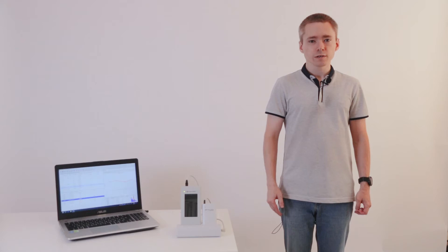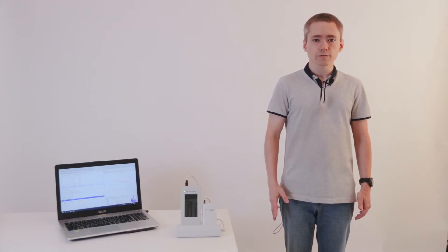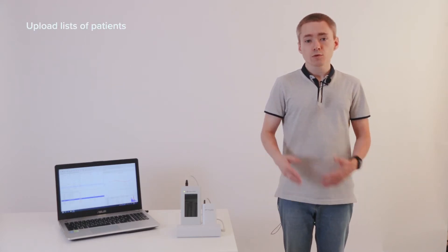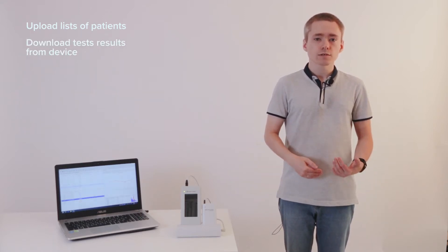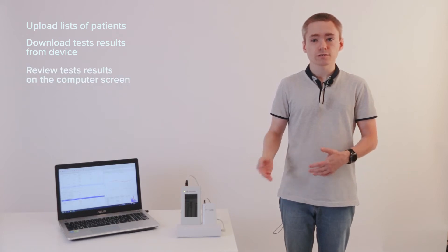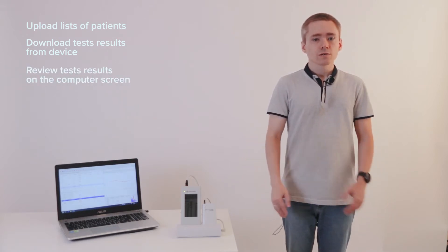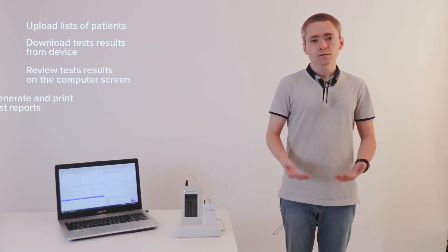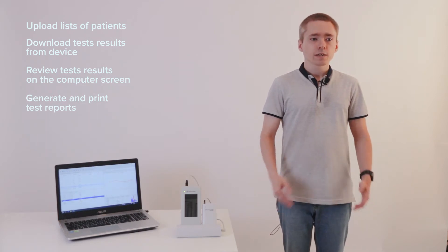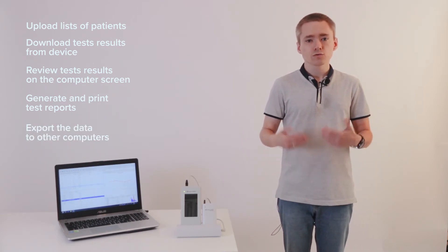The use of software is optional, but it gives you additional tools to manage the data. Using NeuroAudioScreenManager software, you can perform the following actions: upload patients' lists to the device, download test results from device, review test results on the computer screen, generate and print test reports, and export the data to other PCs.